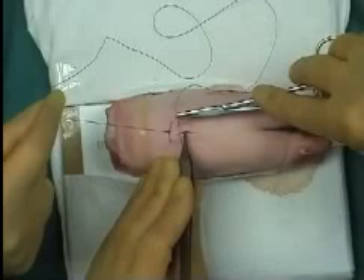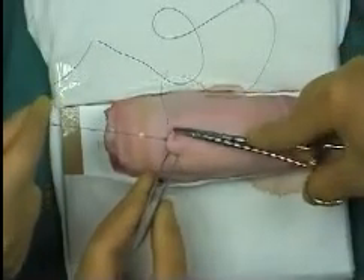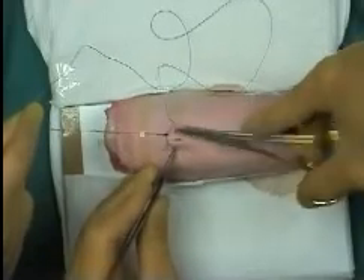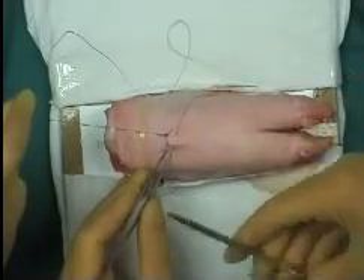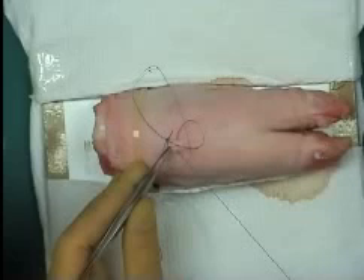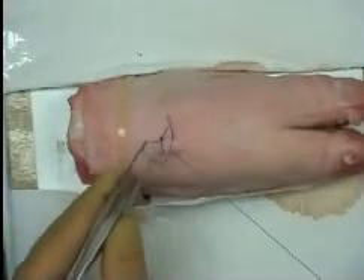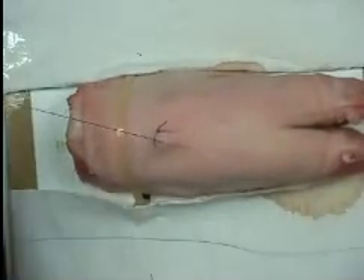The assistant then holds the bite of suture under tension, whilst further continuous sutures are placed to close the incision. It is important to pass the needle perpendicular to the wound, and this will result in the external portion of the sutures lying diagonally.